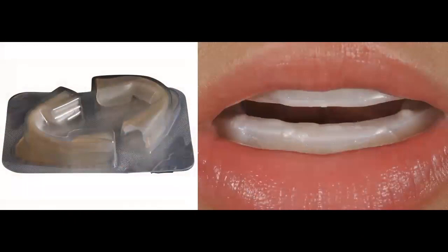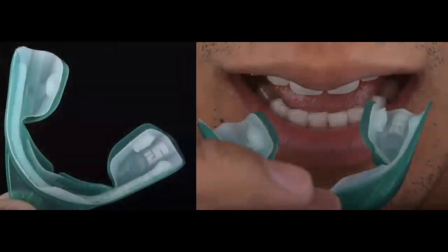So this is the way that the trays come dispensed. These trays come in this plastic covering that you're seeing there, and they come sealed, vacuum sealed. And you have to train the patient how to put these trays. This is literally like a tape that goes onto the teeth, and is literally taped to the teeth. You've got to make sure that you train your patients how to do this, and I'll show you why it is so important. So I'm going to walk you through the process. This is one of my patients. I'm going to walk you through this case because I want to show you step by step how I teach my patients how to place these trays in their mouth.